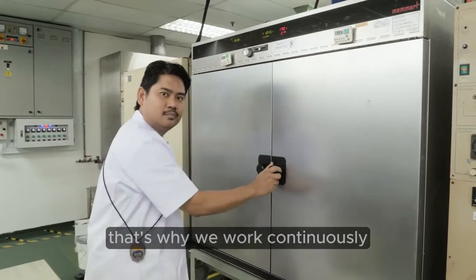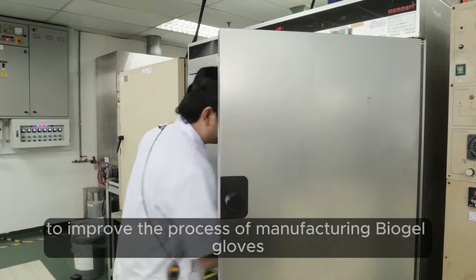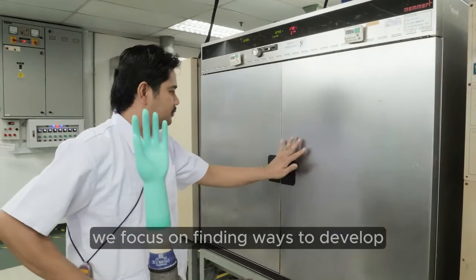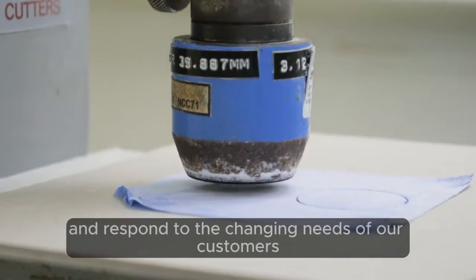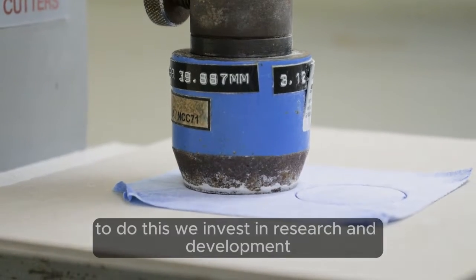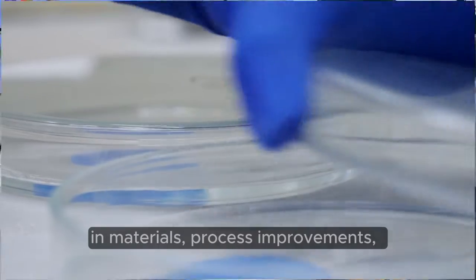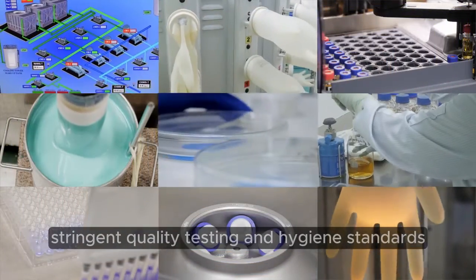That's why we work continuously to improve the process of manufacturing Biogel gloves. We focus on finding ways to develop and respond to the changing needs of our customers. To do this, we invest in research and development, in materials, process improvements, stringent quality testing and hygiene standards.